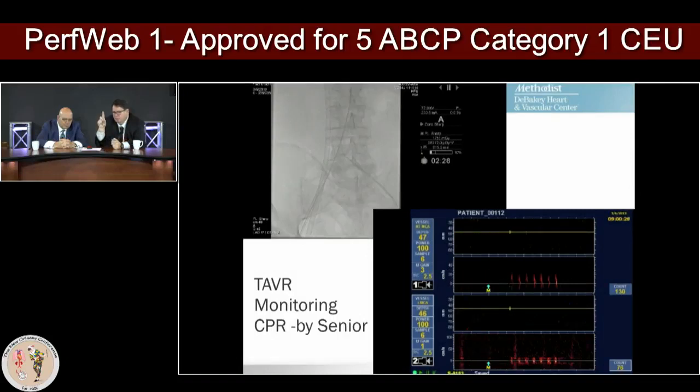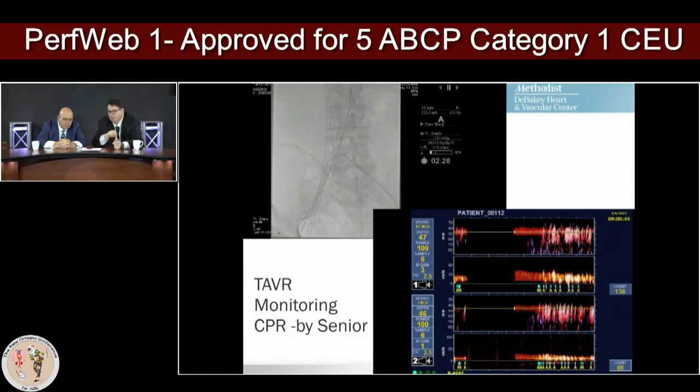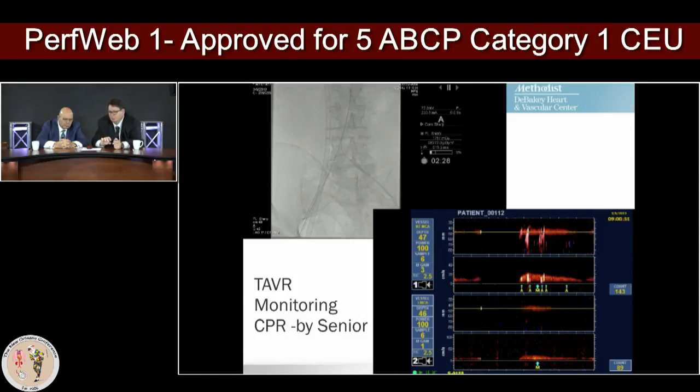Look at the highest peaks. I'm not going to name our senior surgeon, but I think Dr. Reardon will be really happy to see the flow pattern. There it comes. So we're cannulating the femoral artery now, and you see the perfusion starting, non-pulsatile flow, but we have too much air. So we stopped the pump, and we said, okay, let's check connections, let's de-air, and start our perfusion slower.